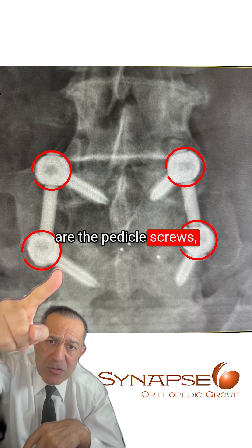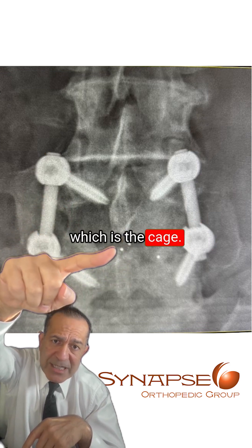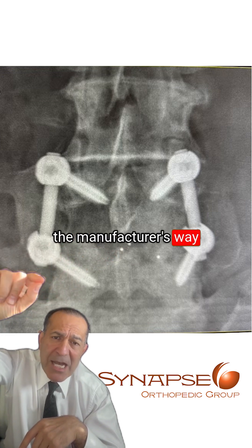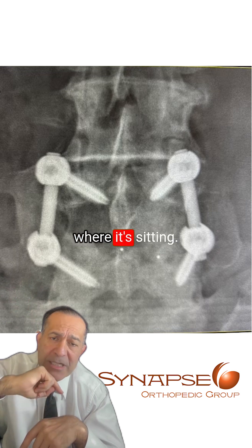These are the pedicle screws, which seem to have been placed appropriately. This is the intervertebral device, which is the cage. And these little dots are the manufacturer's way of labeling the implant so we can see on the x-ray where it's sitting.